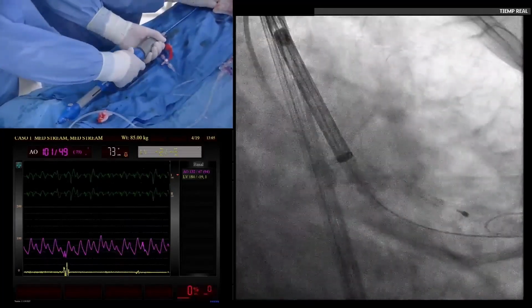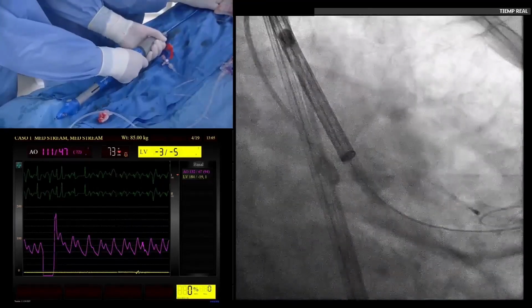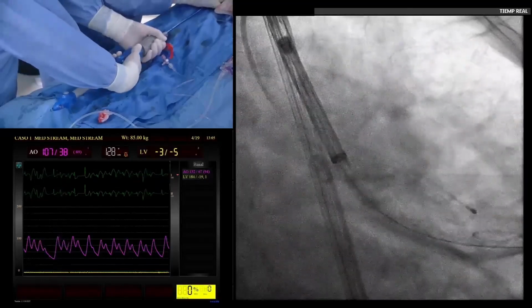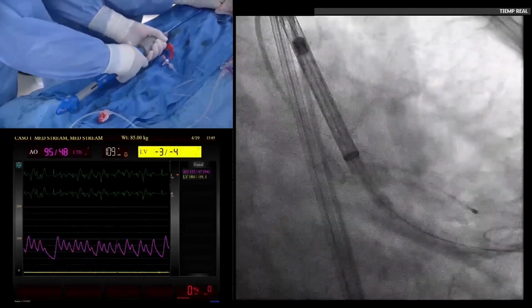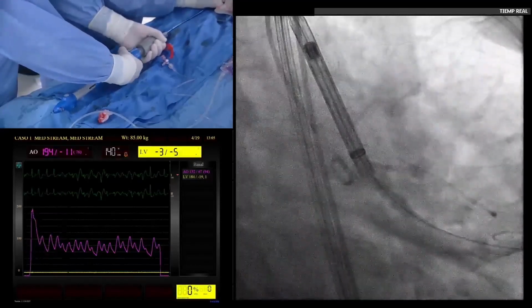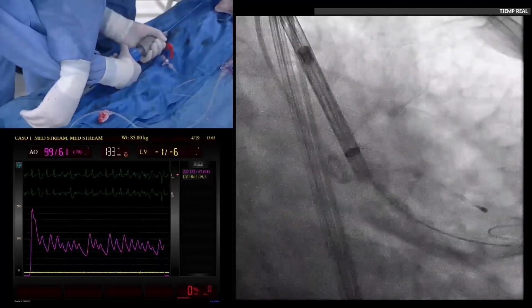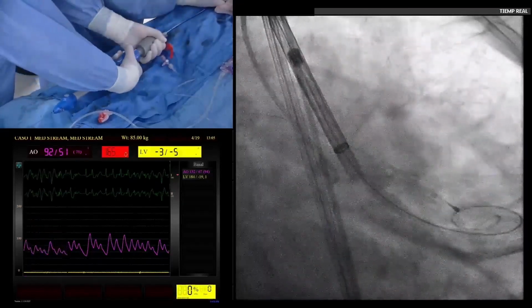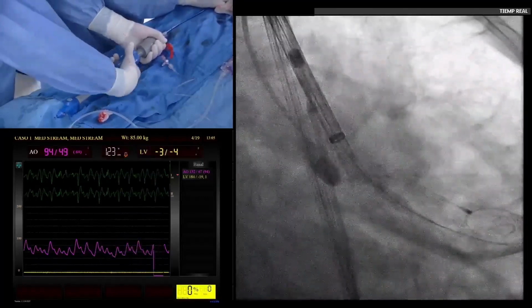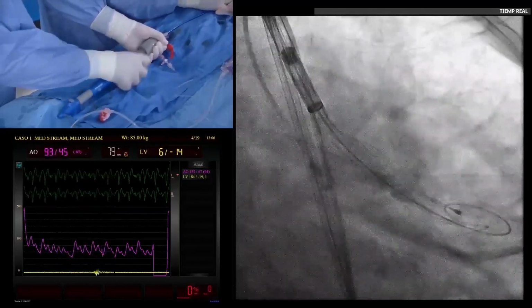One is a very small pass. Perfect. A little bit higher. Carmen is prepared because we are ready to deploy the valve. Pace. Okay, 140. 140. Pull the wire a little bit. It's very unstable. Pace. Let's go, Franco. We cannot go that high as usual. Dale.